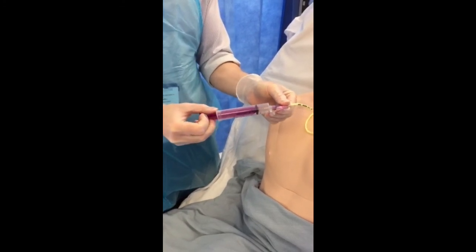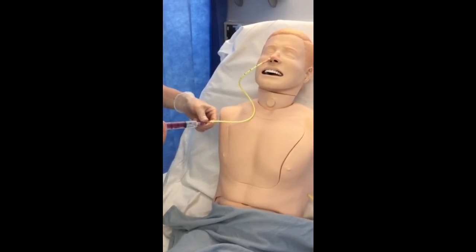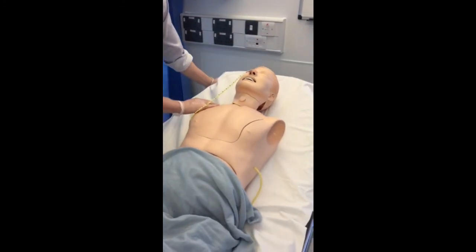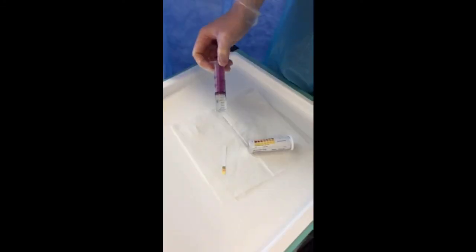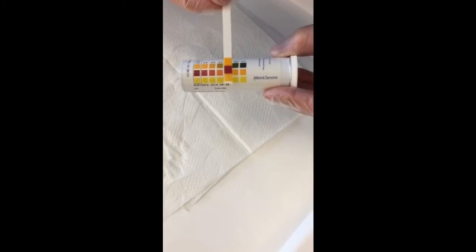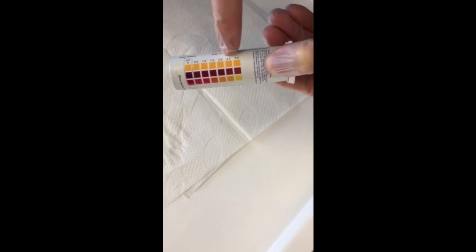Sometimes you will be unable to get an aspirate. The first step is to inject 10 to 20 mL of air down the NG tube and then reposition the patient, usually onto their left-hand side, and try again in 15 minutes. Do not use water to flush the NG before position is confirmed. The National Patient Safety Agency recommends an aspirate with a pH of less than 5.5 confirms correct placement, however local guidelines may vary. If the aspirate does not reach this threshold, then proceed to a chest X-ray.